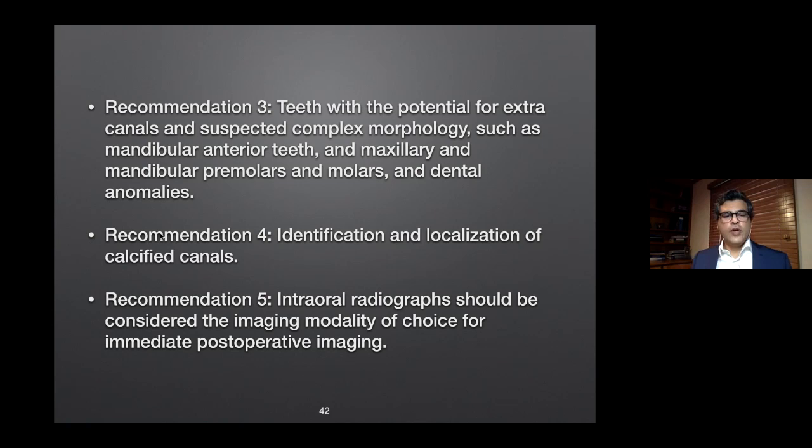Intraoral radiographs should be considered the imaging modality of choice for immediate postoperative imaging. There is a reason for that. One of the reasons is that now it's postoperative, you have completed the endodontic treatment, the root canal filling material is in there. Unfortunately, when we scan root-treated teeth with root fillings in there, they cause artifacts, and that reduces the diagnostic efficacy.